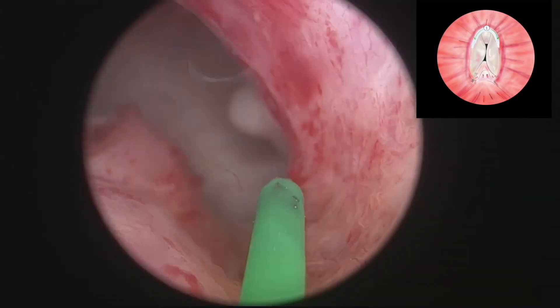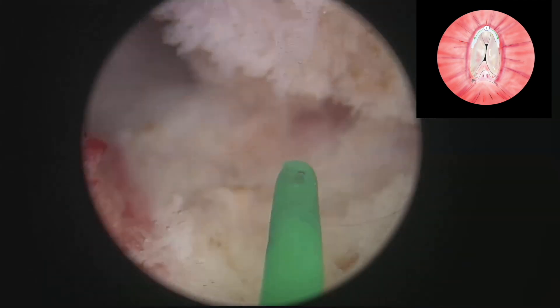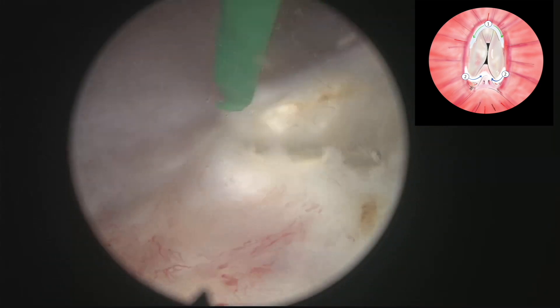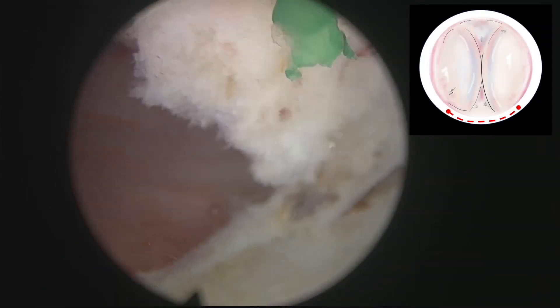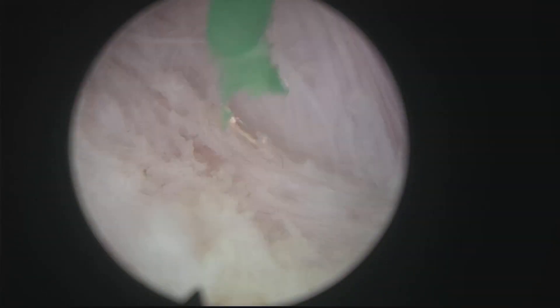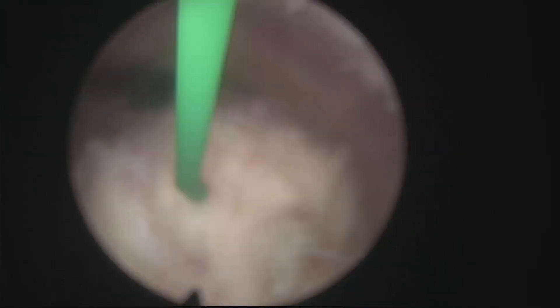Again the same strategy, using the MOSES technology that provides excellent cutting properties and excellent coagulation, especially useful when there is a lot of fibrous tissue. That's again the crista urethralis, or whatever is left of it, on top of the verumontanum, and the circumferential dissection — not settling for what looks like a nice cavity, but trying to follow the anatomical plane between adenoma and capsule. In some areas there might be good original work with tissue taken down to the capsule, but in other areas there is still residual tissue.